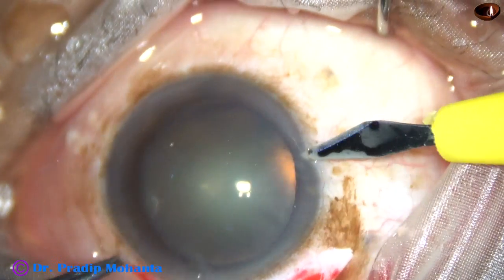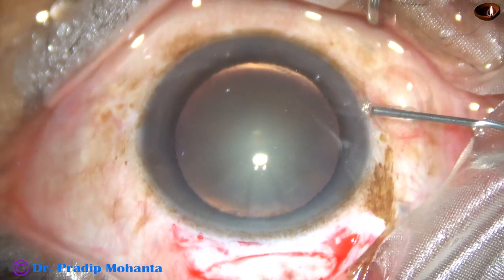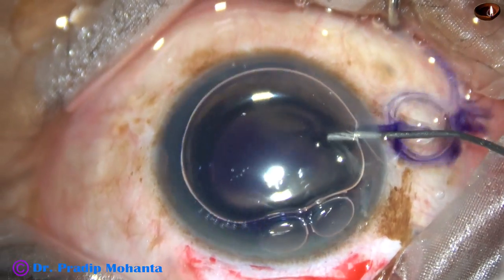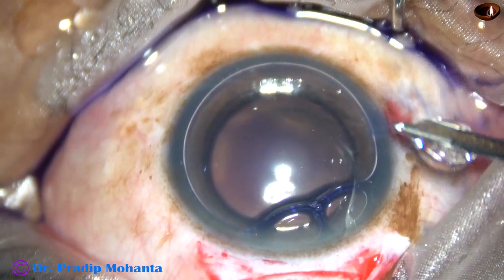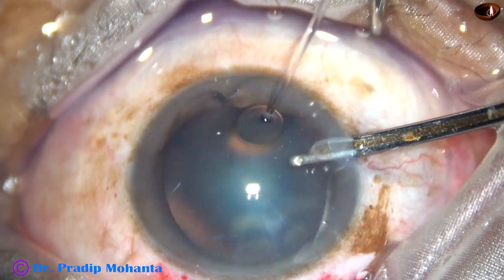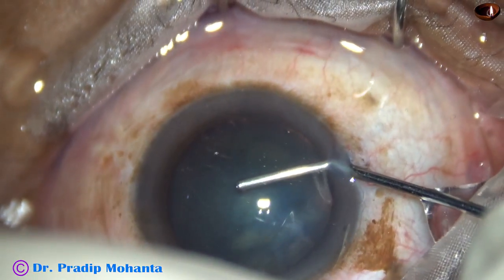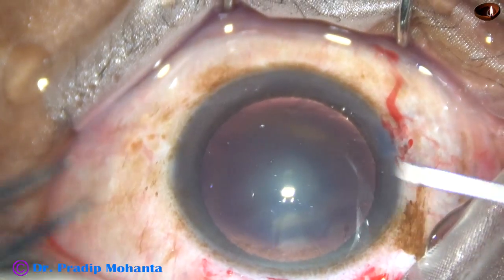This is a side port at nine o'clock. An air bubble is injected into the anterior chamber, and trypan blue dye is applied over the anterior capsule. The dye is then washed out. This is good practice because the dye may cause some inflammatory reaction if it remains hidden under the iris.